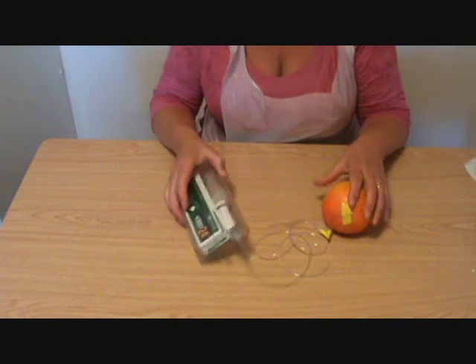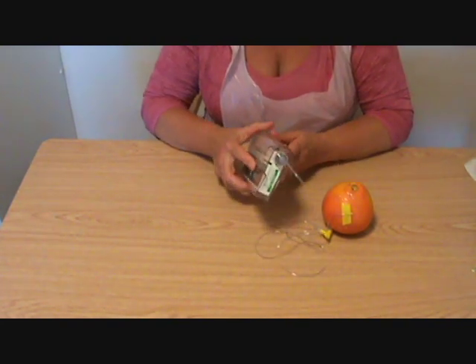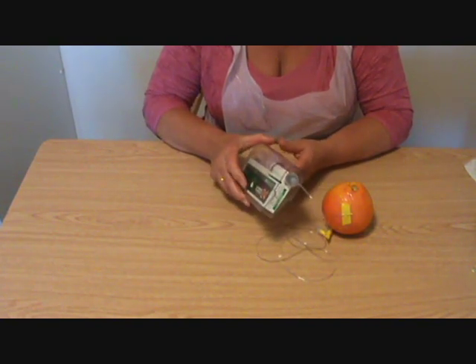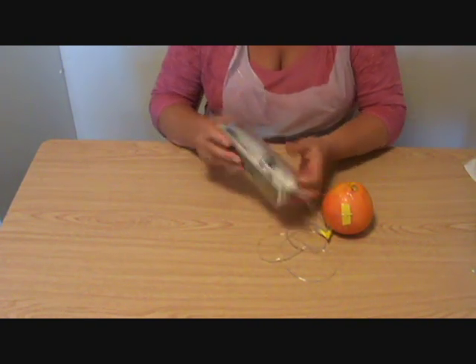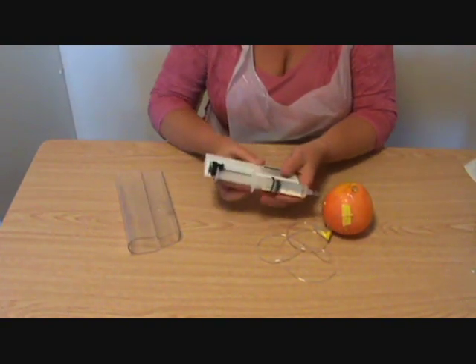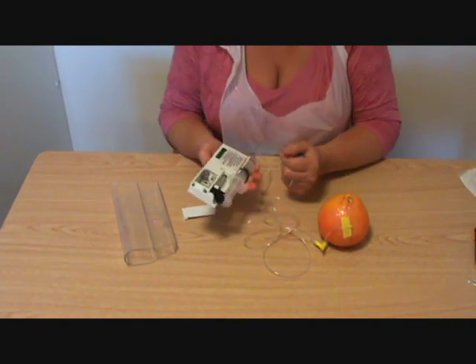I just want to show you how to take the battery out of here easily. You might want to show patients how to do this, because we do use syringe drivers at the end of life. And when patients die, one of the most difficult things I've heard from relatives is that they hear this whizzy sound going on when their loved one is dead. So it's quite nice to be able to show them how to prevent that. All you need to do is just open the back, show the battery, and then give a really sharp tap.